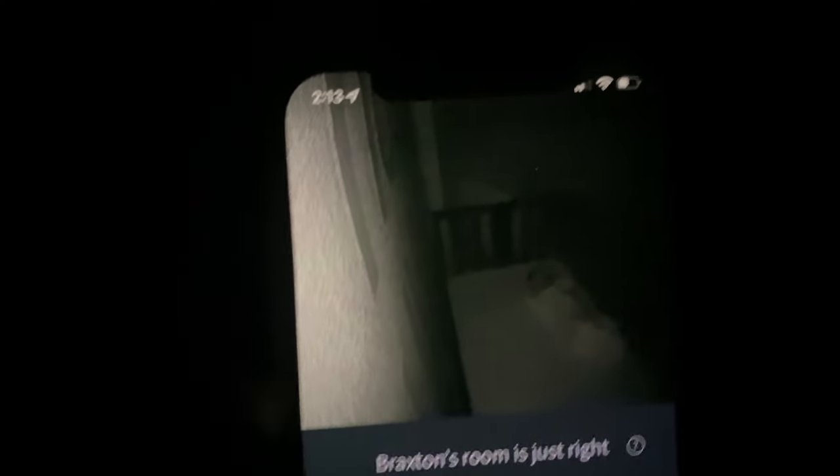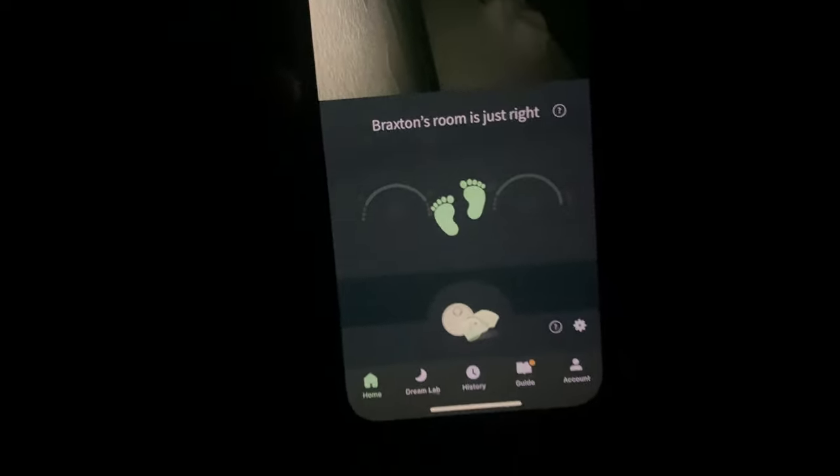When Braxton was super new and we first brought him home, we'd have the app up on both our phones in bed, both looking at the monitor and the phone at the same time. Now that he's grown and we're a little more confident, we check on it randomly through the phone app while we're in bed. If there's any alert tunes, we can silence them temporarily from our phone so they don't keep playing on the charger dock in his room and wake him up. The only time we had a red alert was when he was really new — his oxygen dipped a little too much overnight — but everything was okay.